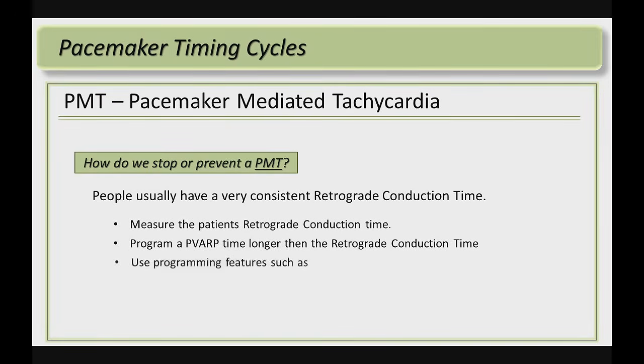Another thing that we can do is use programming features such as PMT termination algorithm and PVARP extension after PVC. Now I'm not going to go into any more detail about these programming features such as PMT termination algorithm because every company's algorithm is just a little bit different.